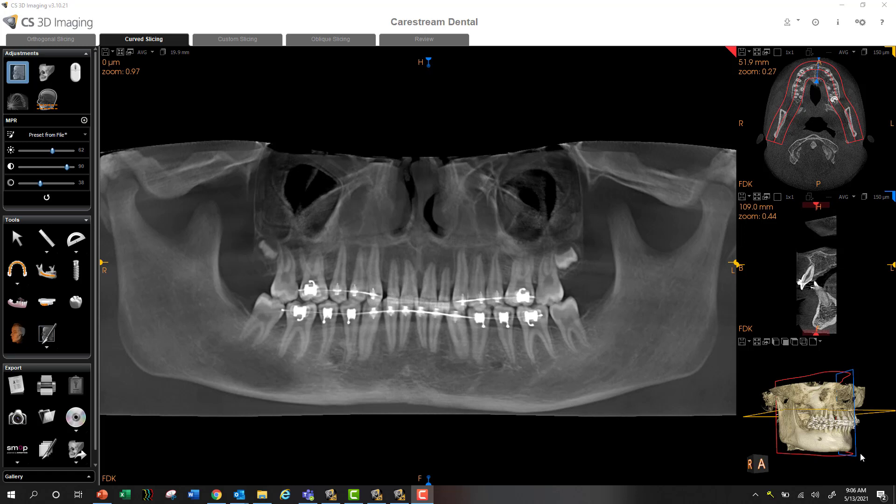Hey, what's going on? This is Phil Leinberger and I wanted to make a little video showing how to grab a panoramic image from your CS3D imaging software and drop it right into your OMS or orthodontic imaging software.